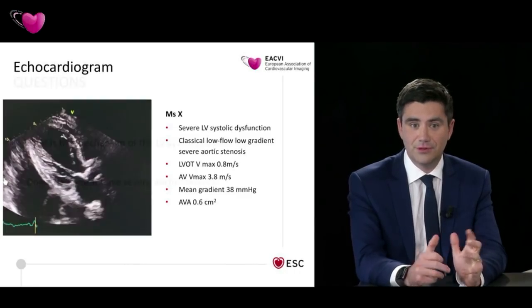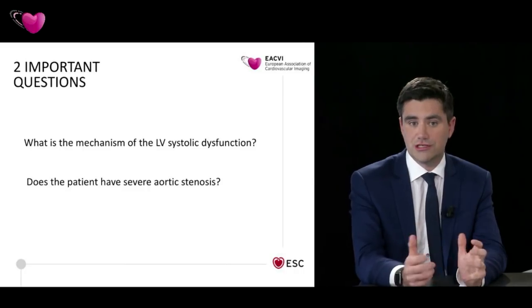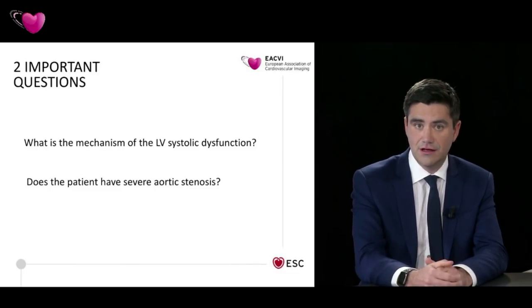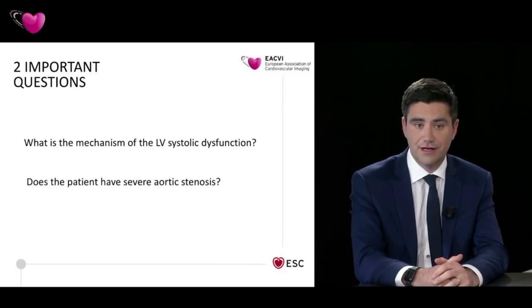So, putting that all together, I think we really had two clear questions in our mind. And the first was, what is the mechanism of this lady's left ventricular systolic dysfunction? Is it related to her valve disease, or is there another pathology that has caused it and contributed to her cardiac failure?